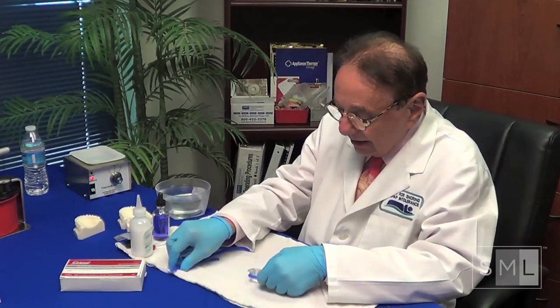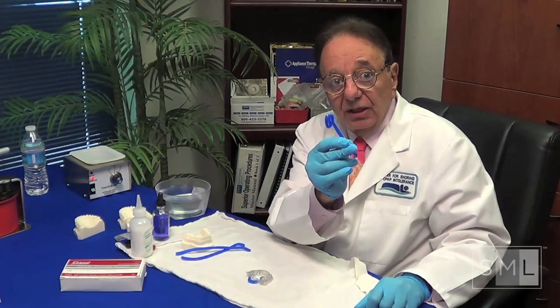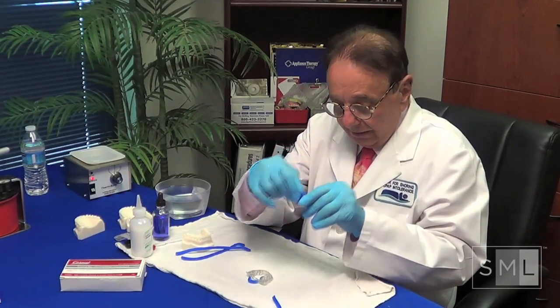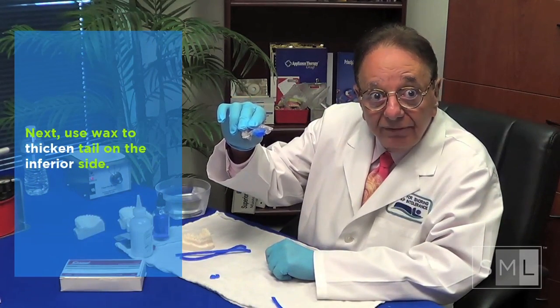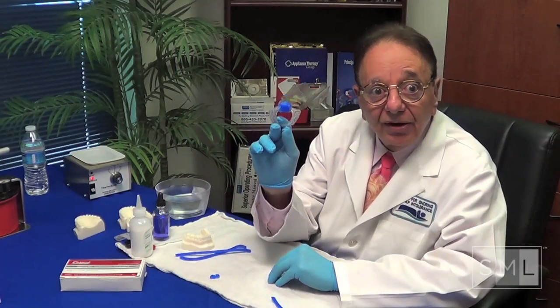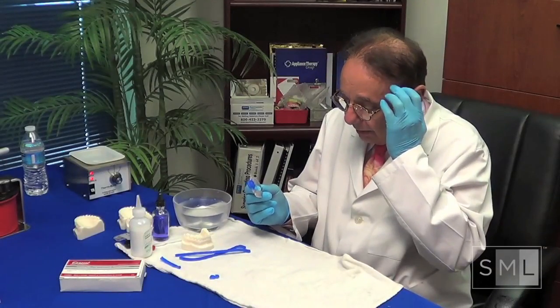Now we're going to do step two of the first addition. We're going to take some more of this wax and fold it three times, then cut it off and place it right back. On the underside — the inferior of the tail — we've made it thicker. We're starting the depression. Here's what it looks like from the inferior: the three bars. And here's what it looks like from the side: the three bars. We've added the wax both in length and inferior.